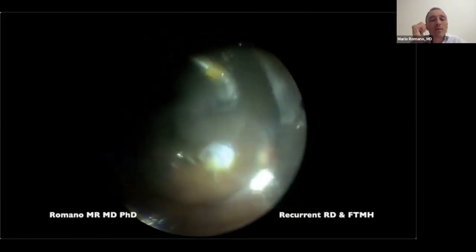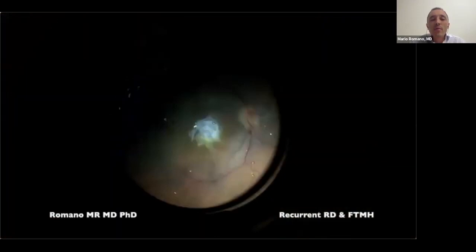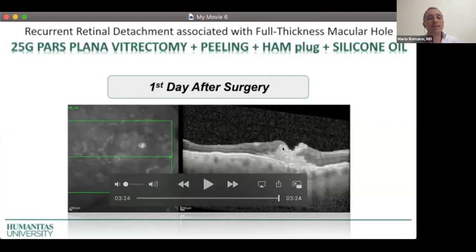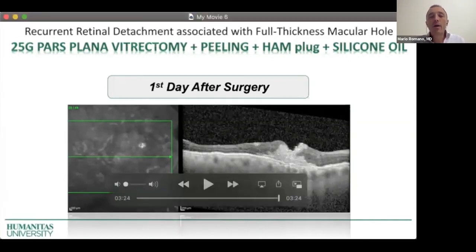And now there are several publications on human amniotic membrane and macular hole and also retinal detachment. And now you will see, we are still at the end of operation with silicone oil in. This was one day after: there was a nice plug, the retina was attached, it was dry. And so the patient, at least, was happy that there was no detachment anymore. Of course the visual recovery was not so high, 0.1, but that was a recurrent retinal detachment with a very poor prognosis. So if you like, I will do the presentation first. Yes. And then we can speak about the boat.